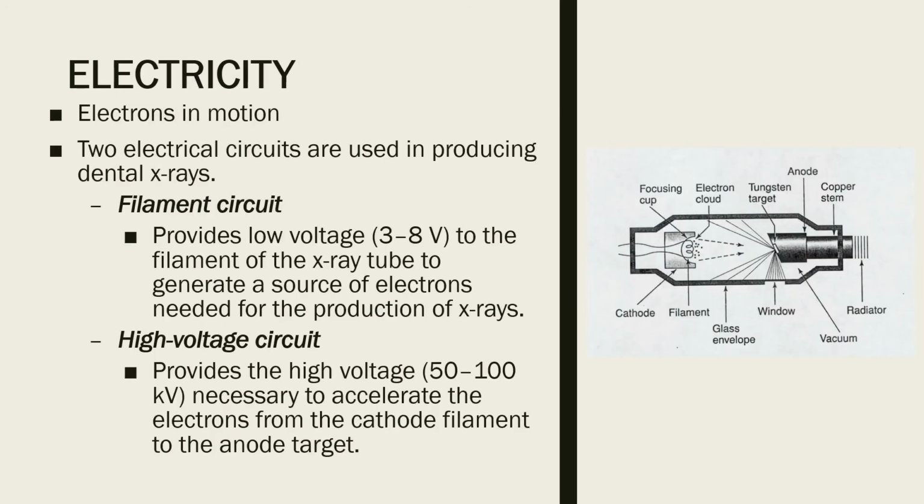As mentioned, electricity is the source of energy in X-ray production. So electricity is needed to produce dental X-rays. So it is necessary for us to have an understanding of the basic electrical concepts and terminology. Let's start with electricity. Electricity can be defined as electrons in motion.